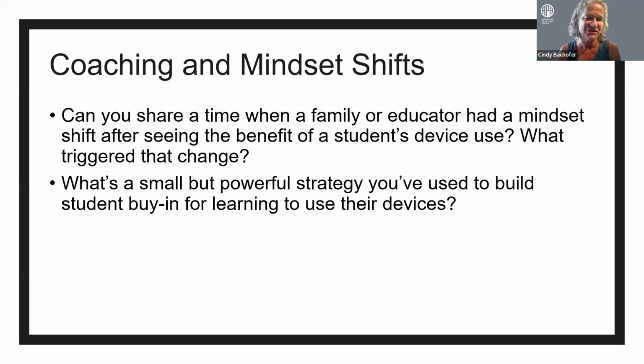I think another one, and I had said that earlier, is bringing a group of students together. I think Tara had mentioned, if they're with a peer who also has low vision and they're using the tools together, it's more appealing for them. And also that the adults around them, whether it's families or neighbors, are encouraging that device use. Not as much pestering and nagging, but positive support to encourage getting that visual access. I think all three of those help the student understand how valuable the tool can be.